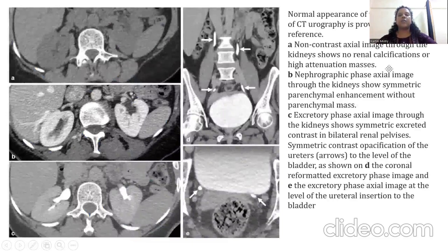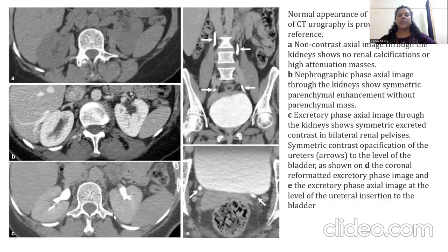Here we can see the normal appearance of the three phases of CT urography. Image A is a non-contrast axial image through the kidneys where no renal calcification or high-attenuation masses are noted. Image B is the nephrographic phase showing symmetrical parenchymal enhancement without any parenchymal mass lesion. Image C is the excretory phase through the kidneys showing symmetrical excreted contrast in bilateral renal pelvises and symmetrical contrast opacification of the ureters at the level of the bladder. Image D is the coronally reformatted excretory phase image, and Image E is the excretory phase axial image at the level of the ureteral insertion at the bladder.